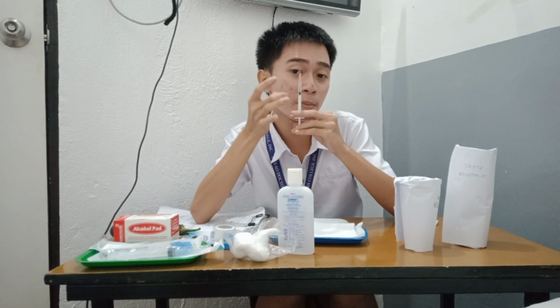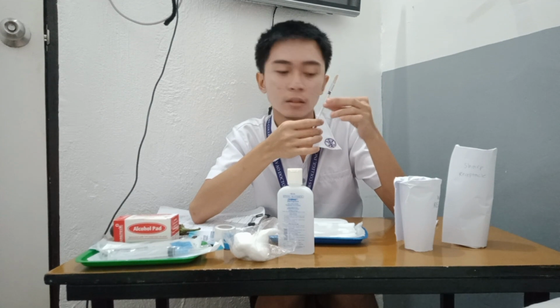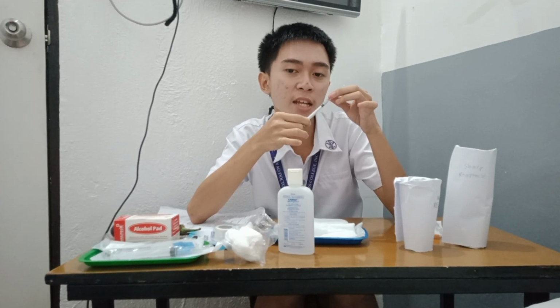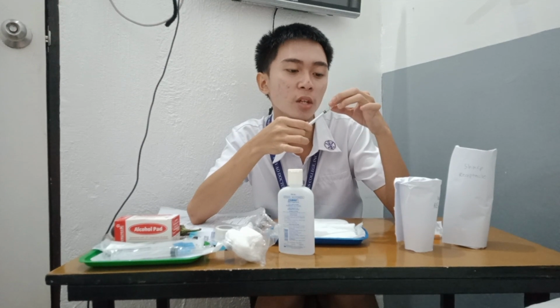Inside the syringe, lightly tap the barrel and expel the air bubble. Then I'm going to remove the aspirating needle and dispose of it in the receptacle to avoid needle prick injury.